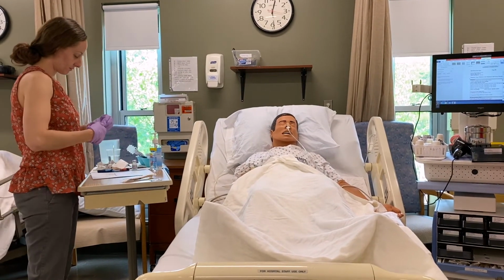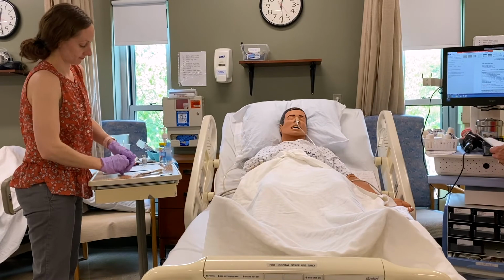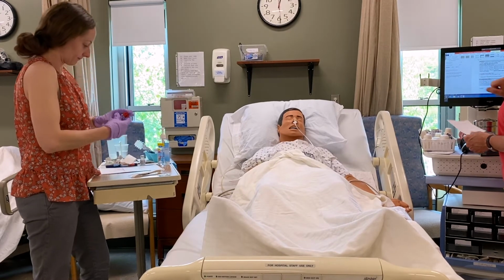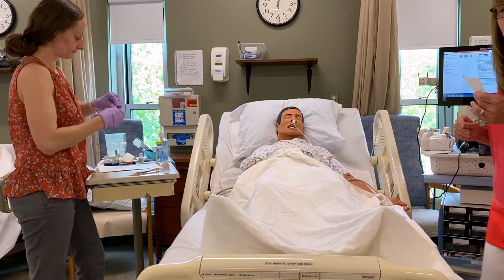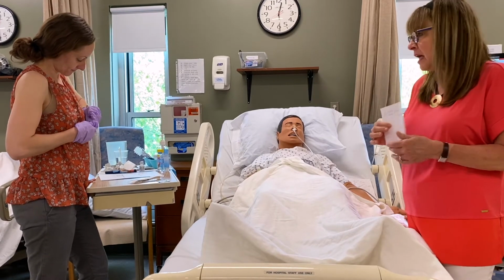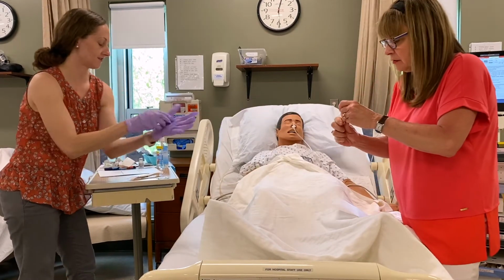And the Solumedrol. This is a powder, and she did her math over here. The Solumedrol came in a dose of 100, the desired is 100. What we have is 125 milligrams on hand per 2 mLs. And this is a powder, so remember when you have a powder, I'll get that for you if you wish. It can be hard with those big gloves for you.